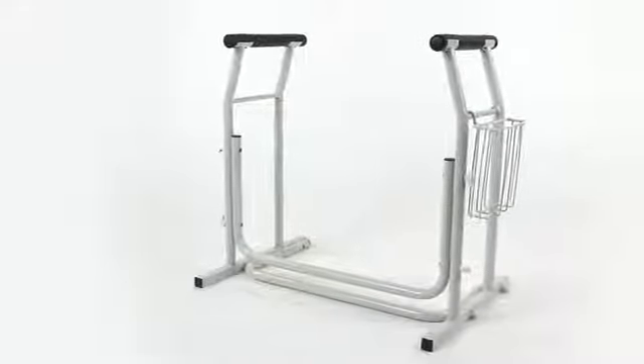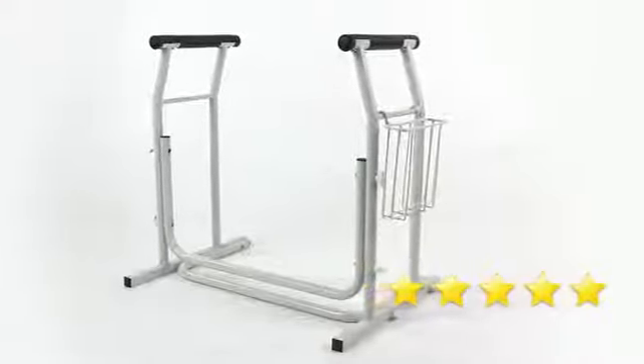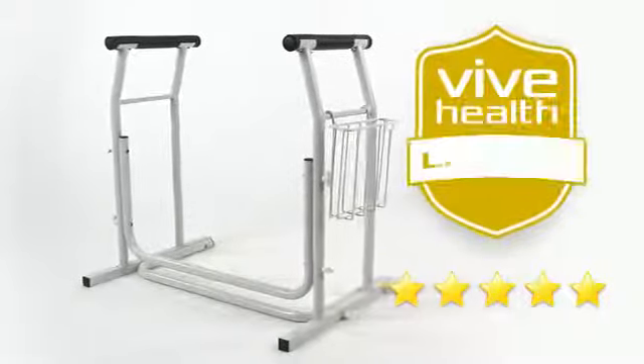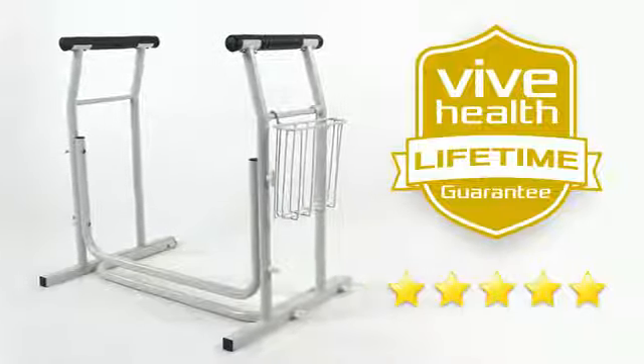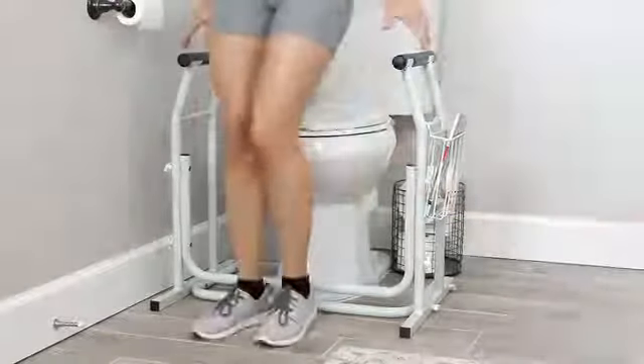The stand-alone toilet rail by Vive is trusted and proven. There are hundreds of five-star reviews, plus it's backed by an unconditional lifetime guarantee. You can't beat that anywhere, so confidently order your rail now for the stress-free stability you need.